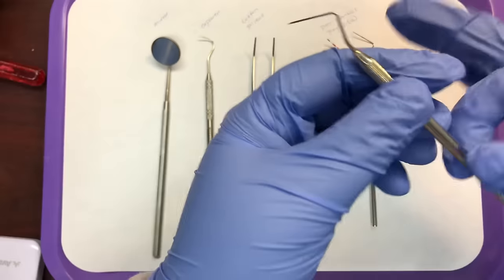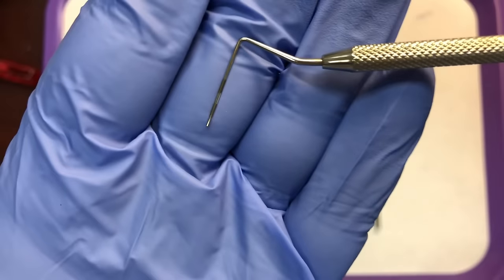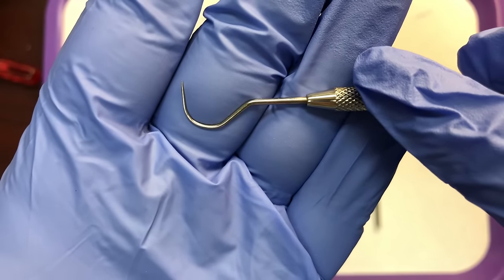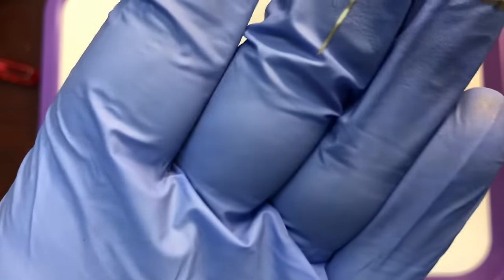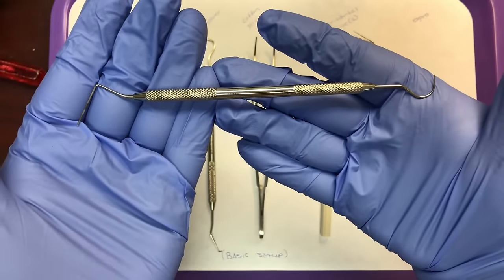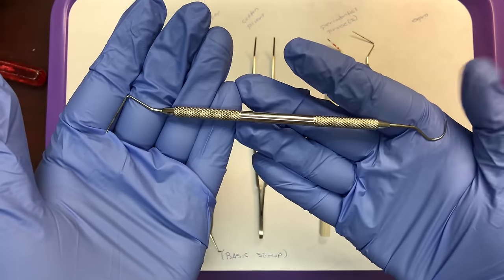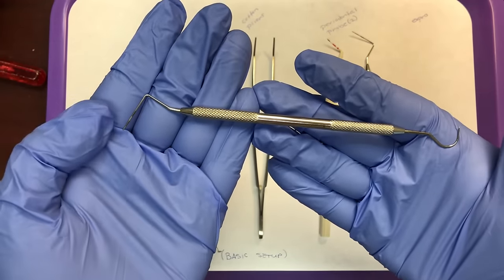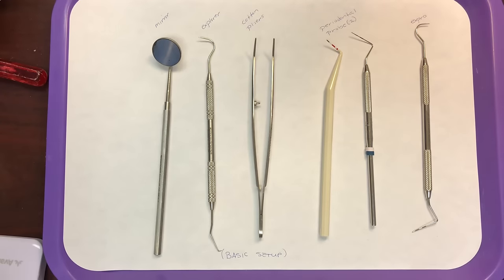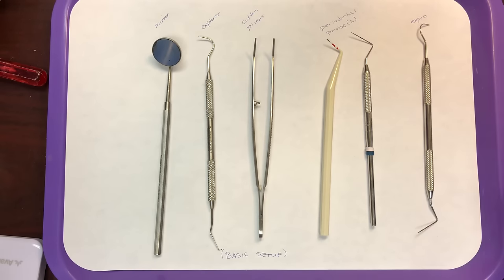The last instrument on this tray is a combination instrument called an x-pro. It combines two instruments: the 'x' comes from the explorer end and 'pro' from the probe end. So this instrument is a combination explorer-probe, and its function is to explore for irregularities and to measure the sulcus depth. Instead of having two separate instruments on a tray, you can have just one, and again that is operator preference.